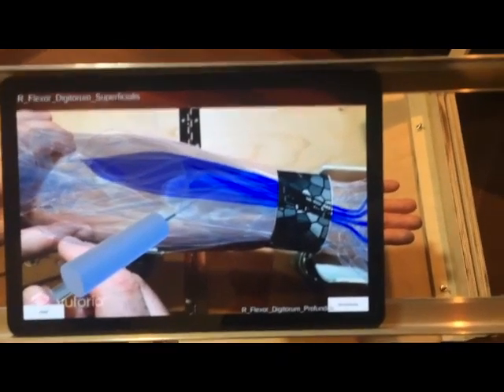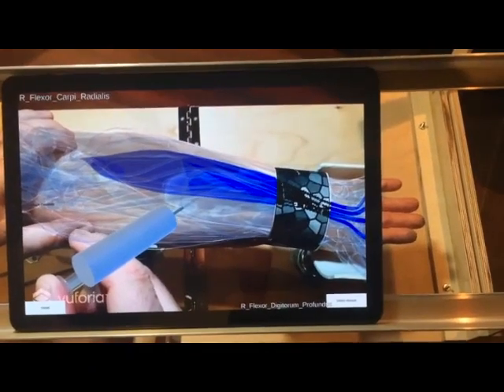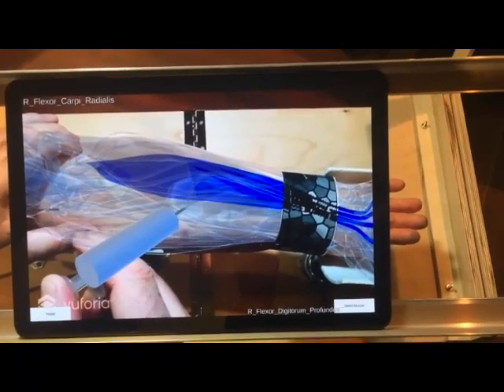There is background EMG sound when the needle penetrates the arm musculature and increased activity when the target is penetrated.